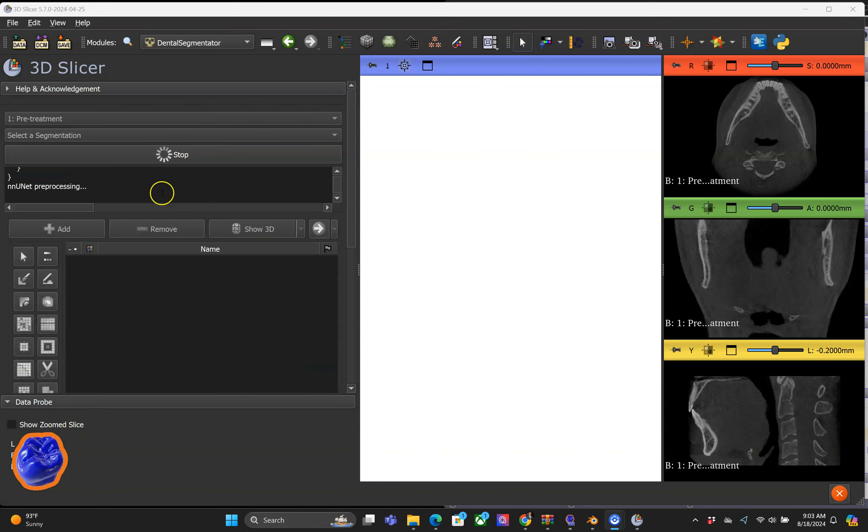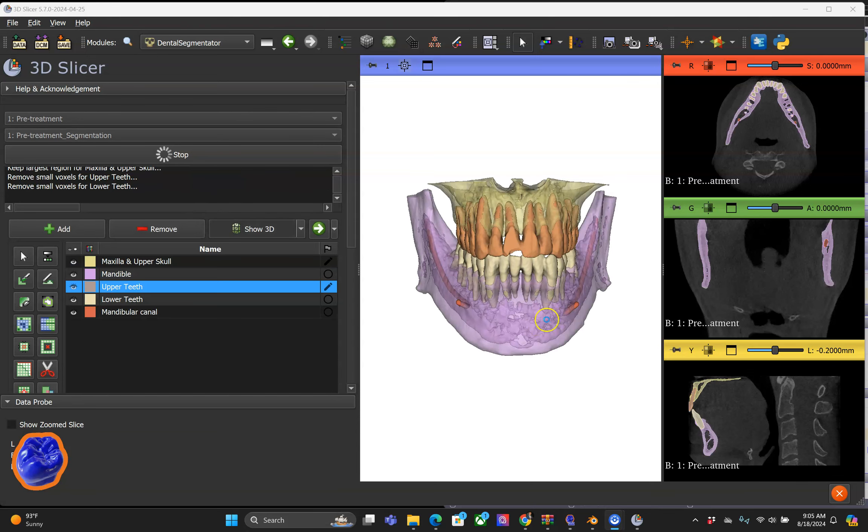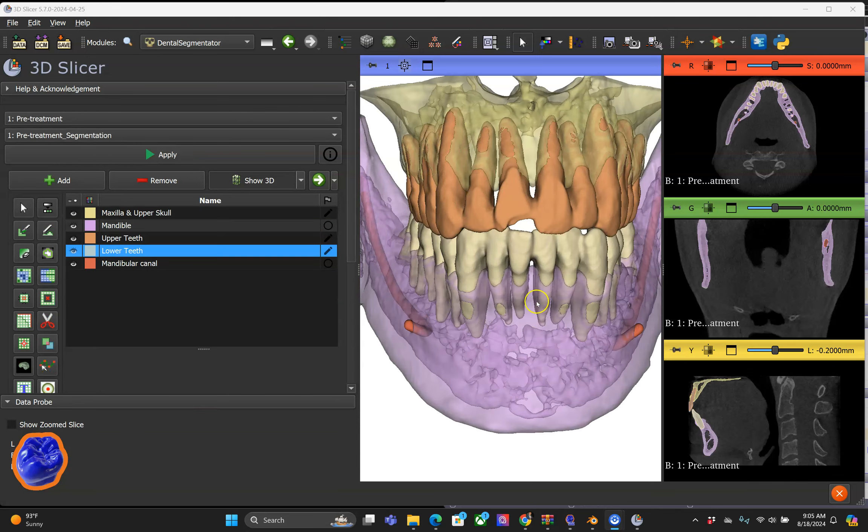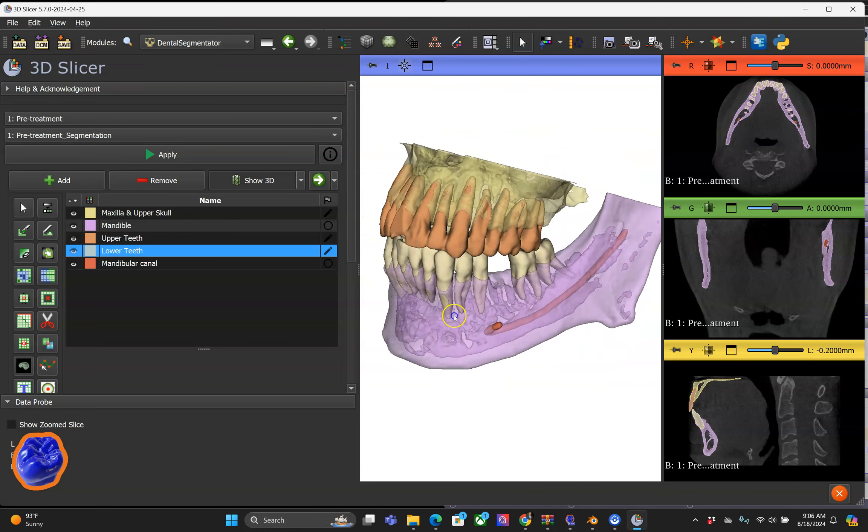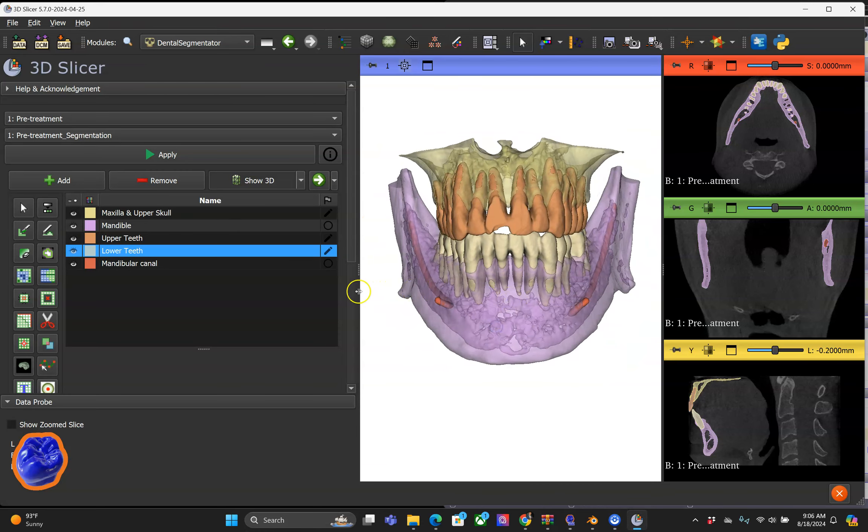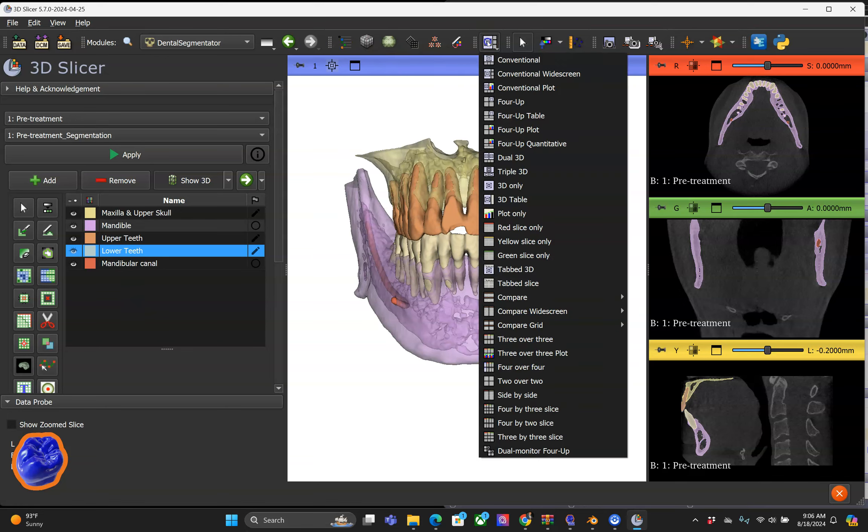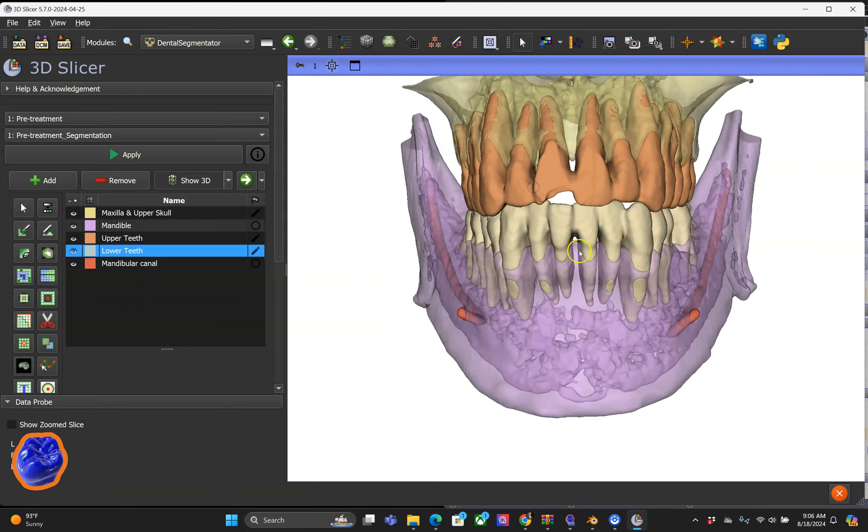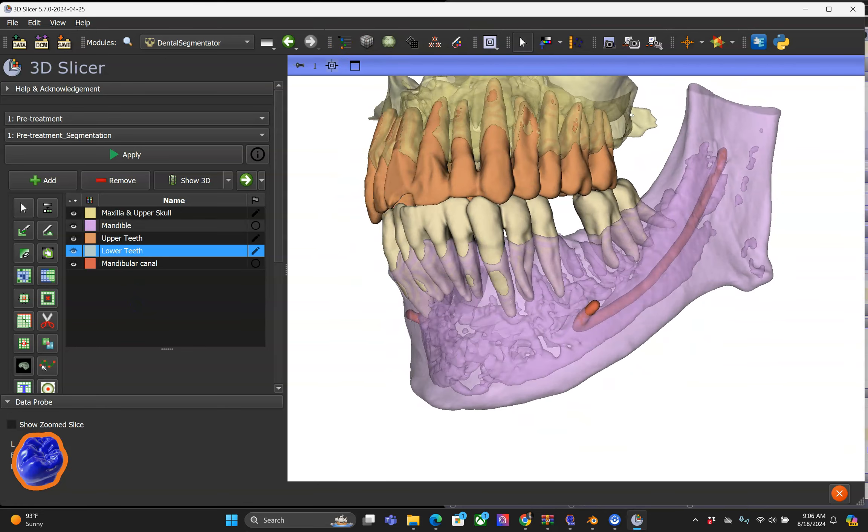Now let me run the AI segmentation. This may take a little while depending on which computer you have. Wow, look at that. Here's the segmentation without any user interaction by a click of a button. In the 3D viewport we can see how incredible this is.